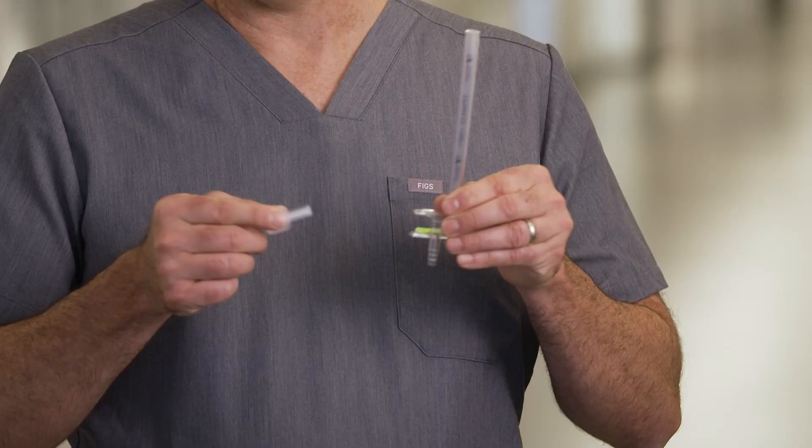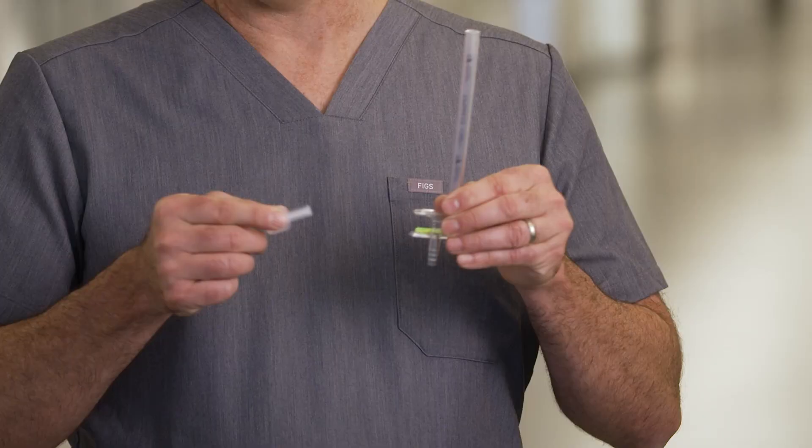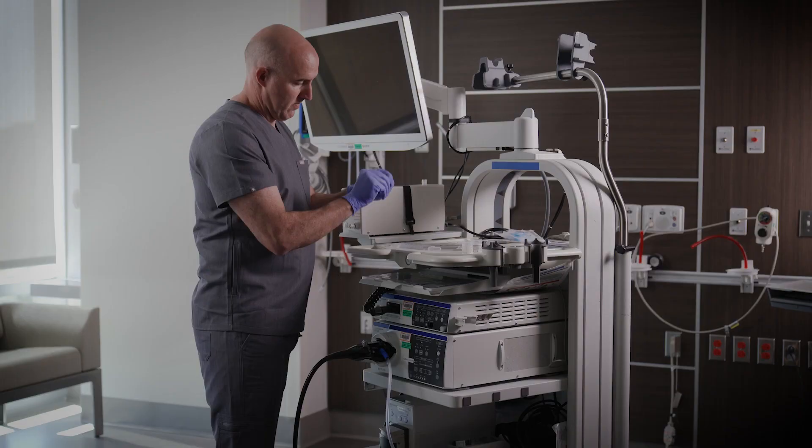If you're ever in the room and there's a poor bowel prep and the surface begins to get a little cloudy, you can simply flip over the bi-directional tray and reinsert it to get a nice clean surface on top. Once you reinsert the tray, you're ready to retrieve your specimen from the scope.